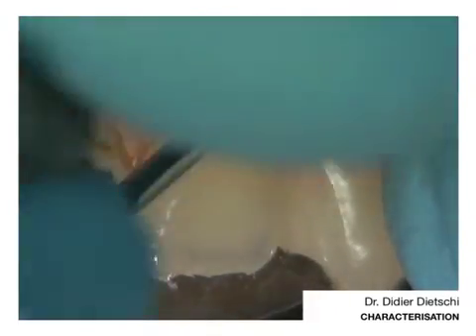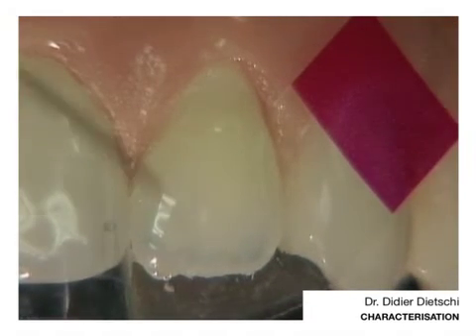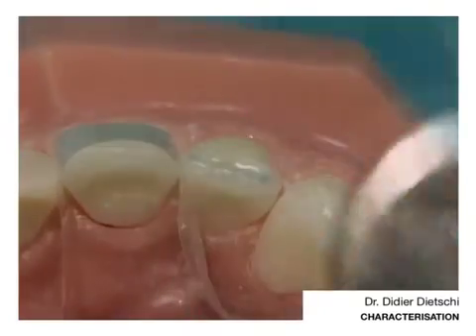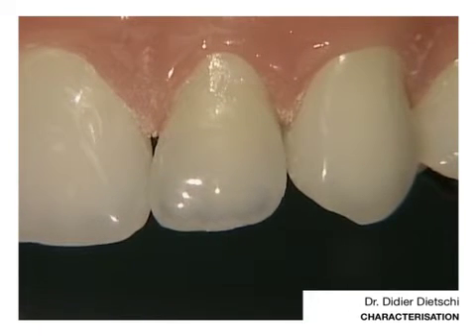Now it is in place. I think I can pretty much take away on the distal the matrix. This will also give me access to the incisal edge. You see now the incisal characterization — it is looking really great. But be careful because not every case shows that kind of translucent halo.